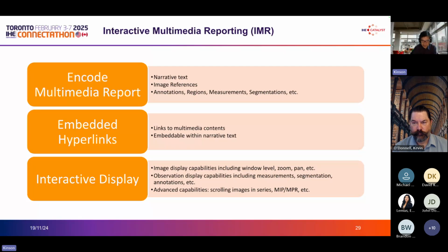And it depends on the different references being captured. There are also specific requirements about scrolling of images, like MPR, MIP, that kind of specific requirements.